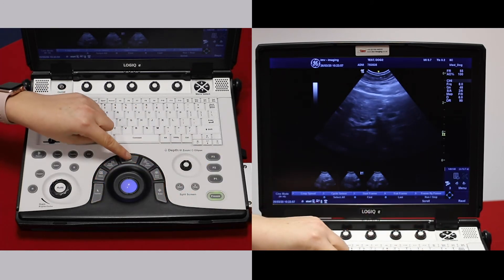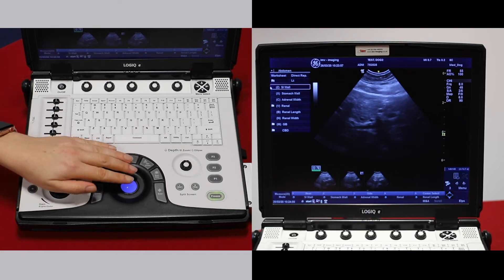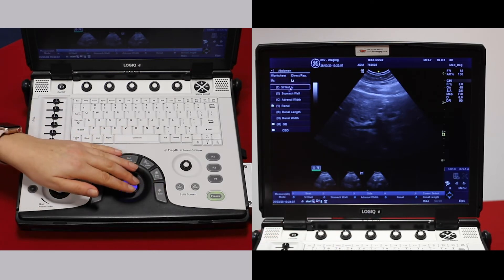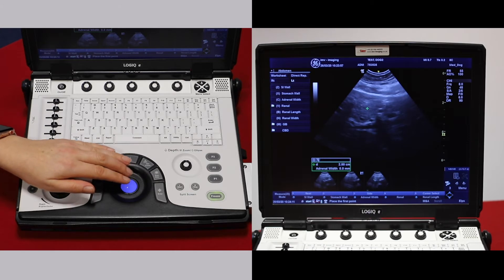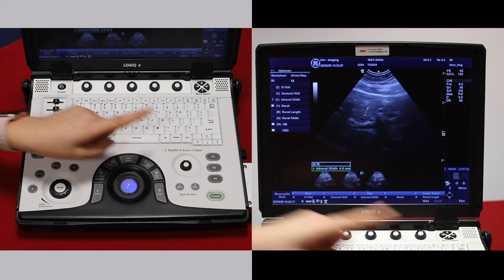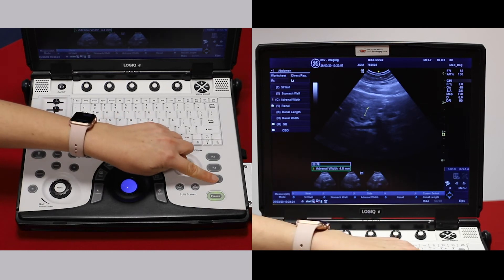Alternatively, freeze the image and press measure. If this is something that has a label, you can choose one — for example, if you want to measure the left adrenal width. You can then place your calipers in the same way as before, and the adrenal width is labeled on screen. Press P1 to save.